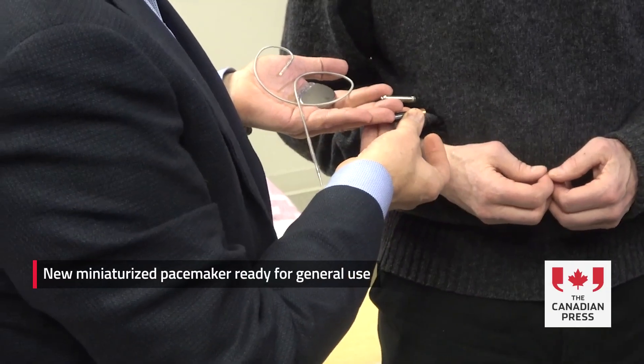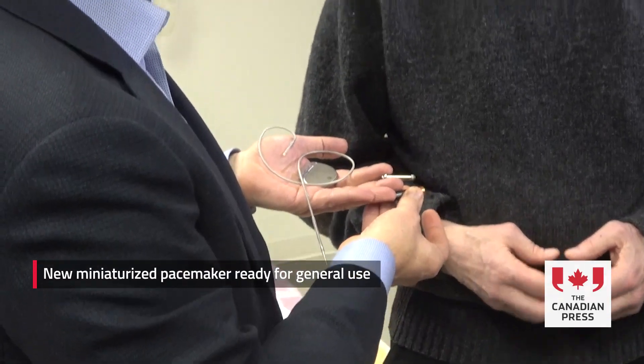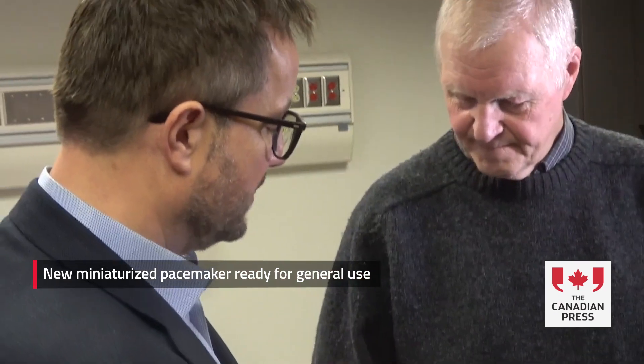About three-quarters, half the size of a AAA battery. The battery on this lasts about 16 years. If I didn't need one, I wouldn't have it, but I do need it, and it works exactly as promised and expected.